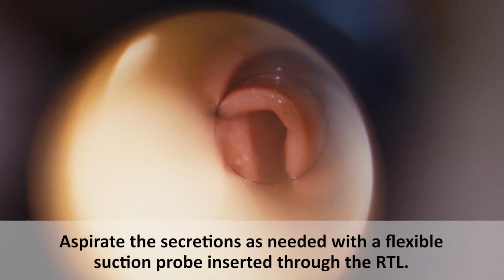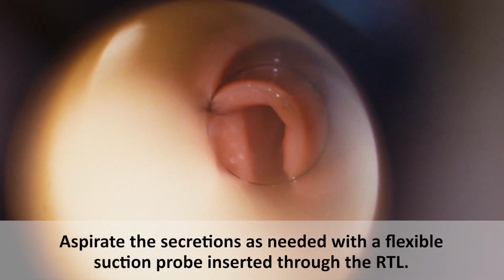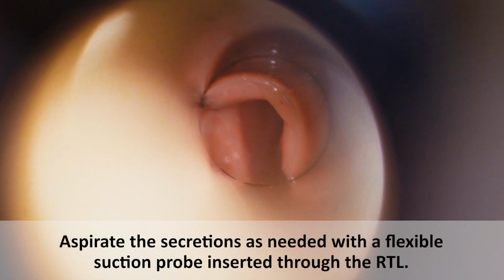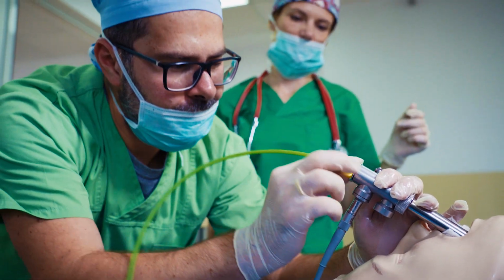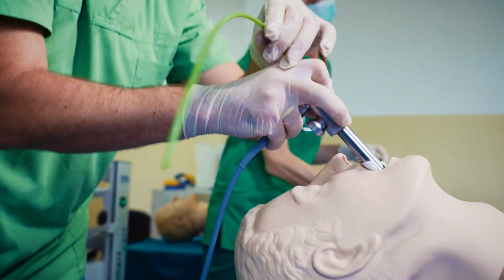Advance the rigid tube slowly until it reaches the epiglottis. Then, lift the epiglottis with the tip of the device. Make sure the bevel is oriented posteriorly. At that point, the glottis should be visible. Once the glottis is in sight, place the intubating tube introducer through the rigid tube into the trachea. Do not insert the introducer too vigorously.